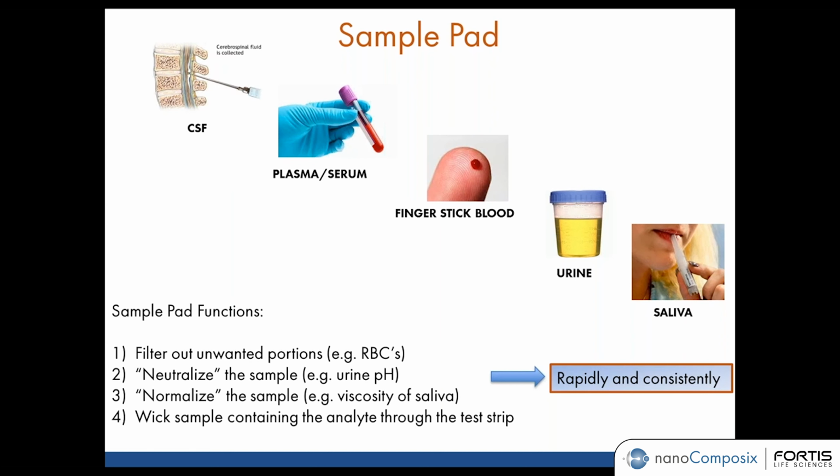More and more focus is being moved towards saliva as a biological fluid for assays because of the ease of collection. There are a wide range of other samples that aren't pictured here, including insects, stool, water supply, and soil samples, among many others.